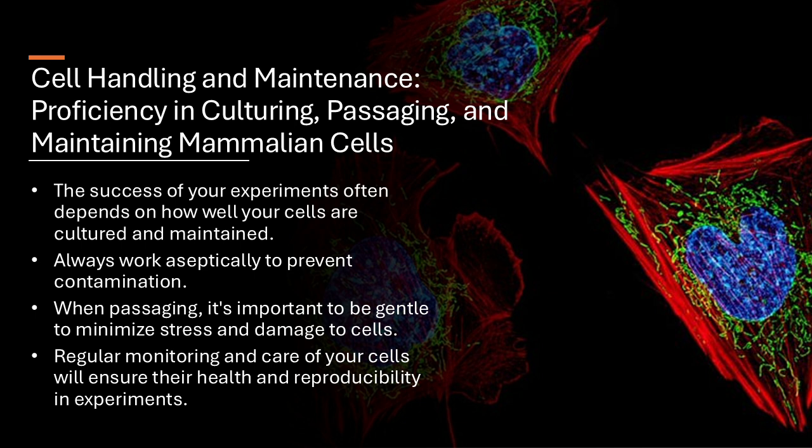It all comes down to aseptic technique. Everything has to be sterile: the workspace, the tools, everything we use. So it's like performing surgery, but on a miniature scale, with every move requiring absolute precision and cleanliness. Intense. You got it. But contamination isn't the only thing that can go wrong.